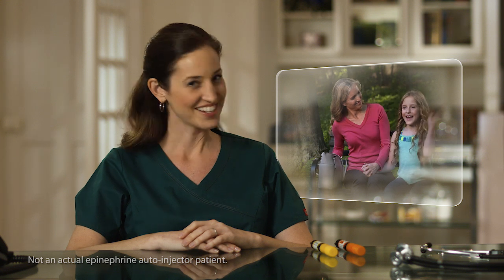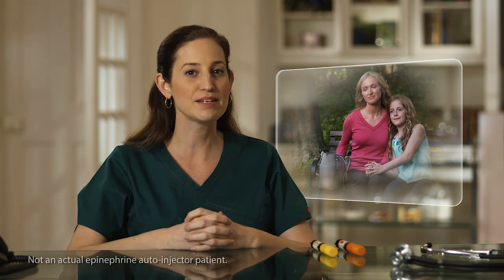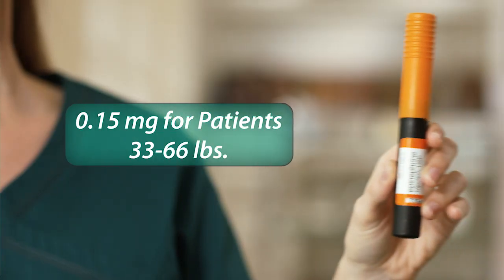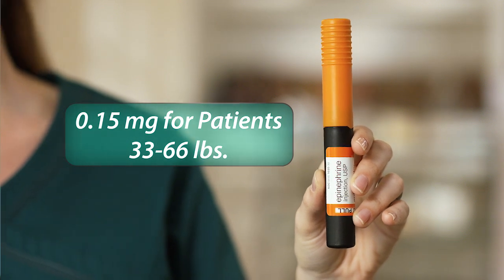What if a caregiver needs to inject another person, such as a mother and her child? Amy is a mom who knows a lot about caring for a child with severe allergies. Jess is going to help demonstrate how to use the epinephrine injection USP auto-injector with a child. For a child of Jess's size, Amy would use the epinephrine injection USP auto-injector with the orange label, which contains the proper dose of epinephrine for people weighing 33 to 66 pounds.